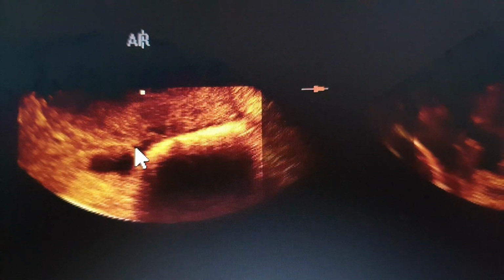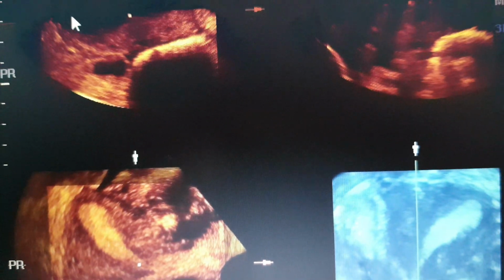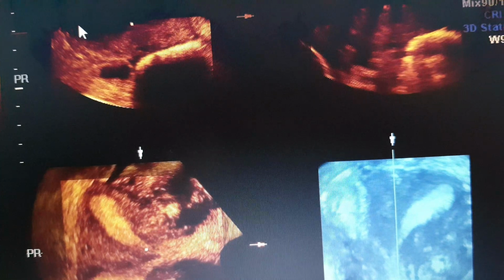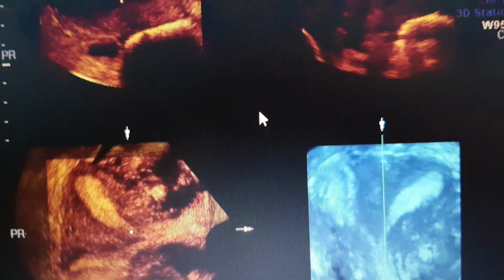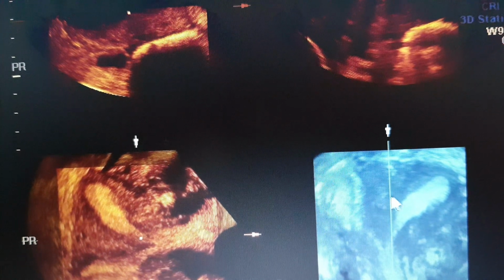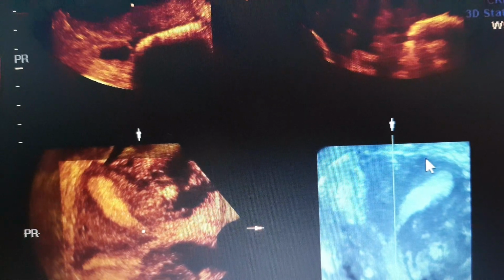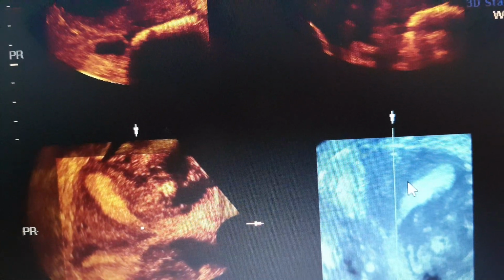As you can see, this is the transvaginal ultrasound, the normal 2D ultrasound, in which you cannot detect by the 2D ultrasound in the longitudinal section that this uterus is septate or bicornuate or didelphys or whatever. But when you use the 3D coronal plane, as you can see here, and I'm focusing on the plane of the endometrium, you'll find that you have two endometria, and there is a continuous myometrium here. And so this is a septate uterus.